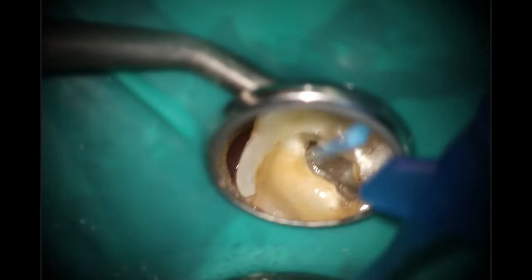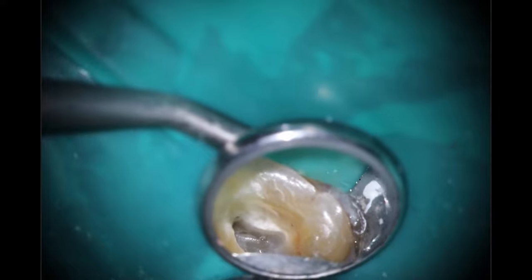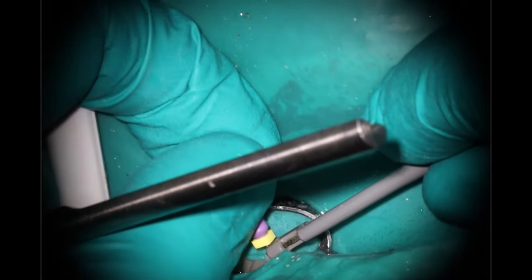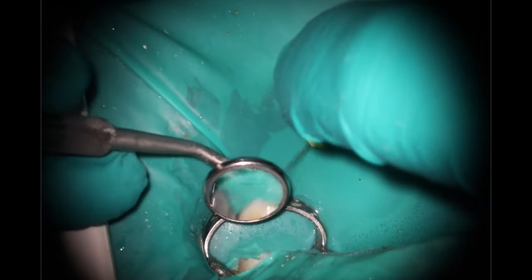So I'm going to go back to the case. Suctioning everything out — at this point I know I'm not down the MB2 and I need to do more work, but I also want to know exactly what my lengths are going to be. Generally your MB2 is going to be close to the lengths of the other canals. It's the one that can be slightly off, especially if it exits to the palatal. I've seen them two to three millimeters shorter than the MB1. But sometimes if you're struggling with the MB2, it just feels good to go back in and take care of the other three canals, get them all cleaned out. I've found that even just rinsing out with bleach actually cleans things out really nicely, and then it's often easier to do the MB2. So if you're struggling, it's okay to take a pause, focus on the other canals, and then come back to it.